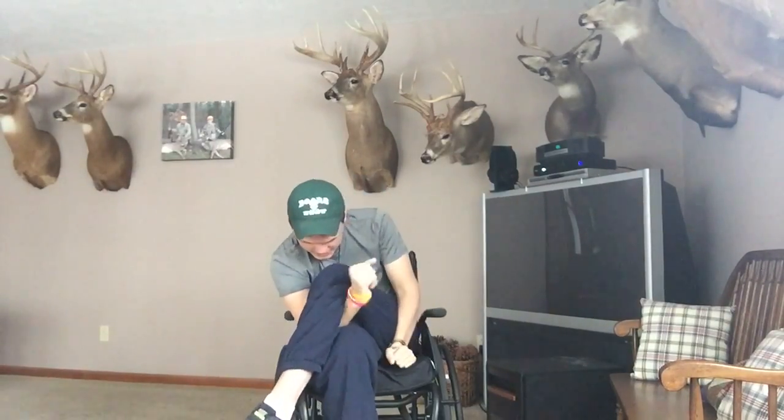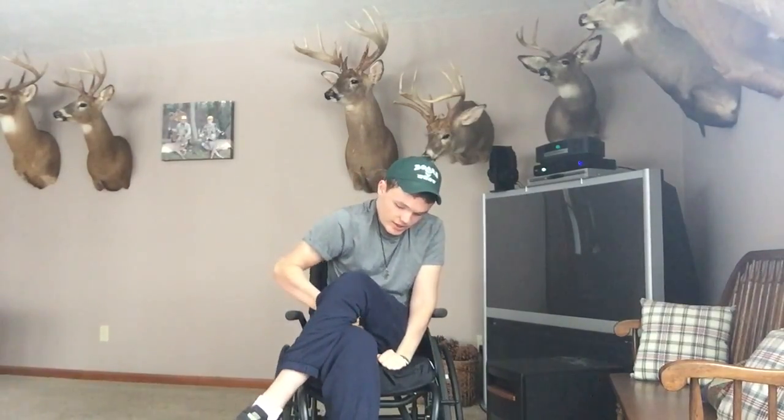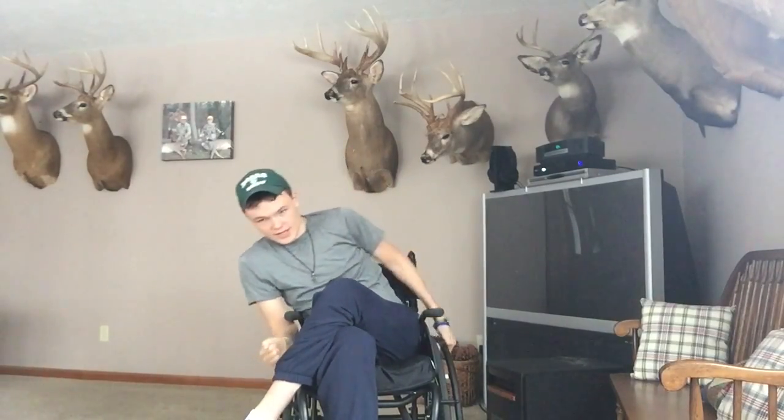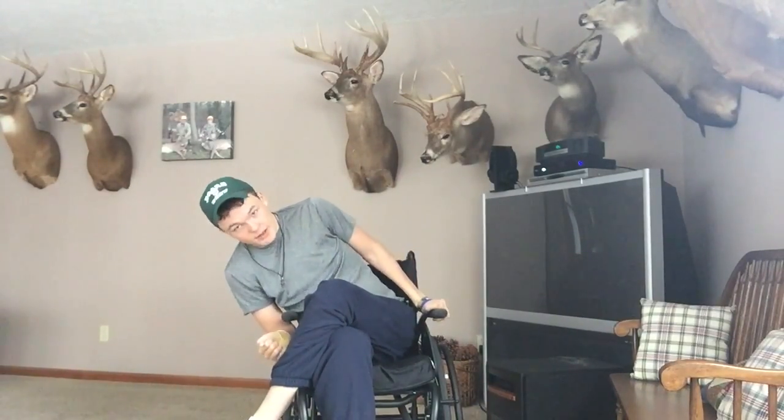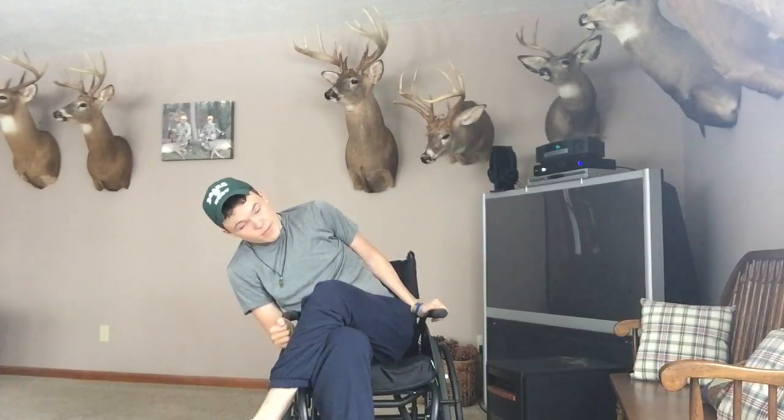Now this one is the same as the last one, as in you will have to do it twice to get pressure off of both sides of your butt, and once again lean over and go like this to relieve pressure even more.